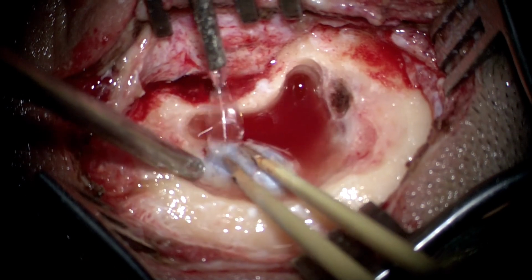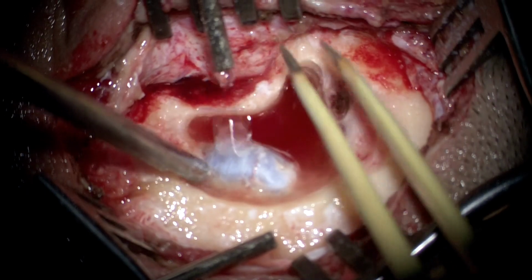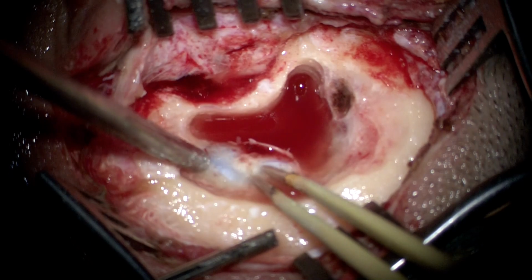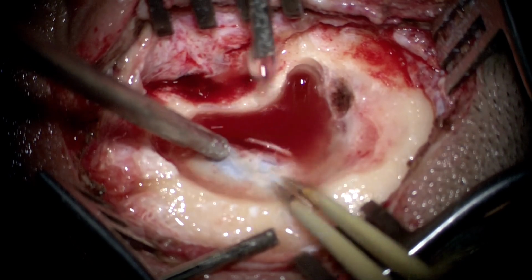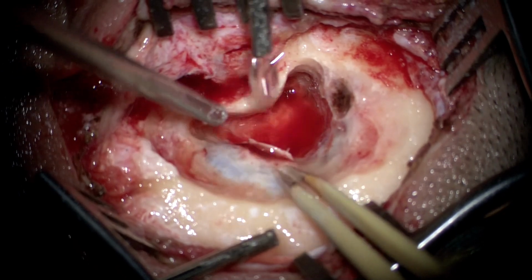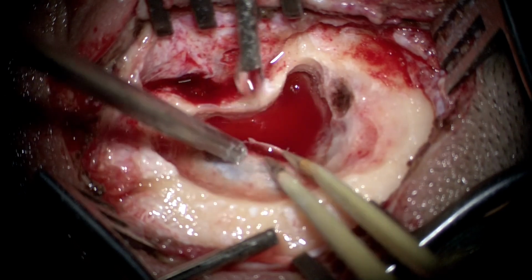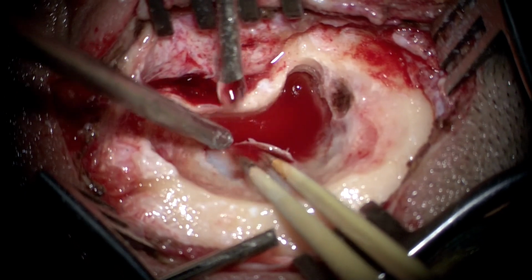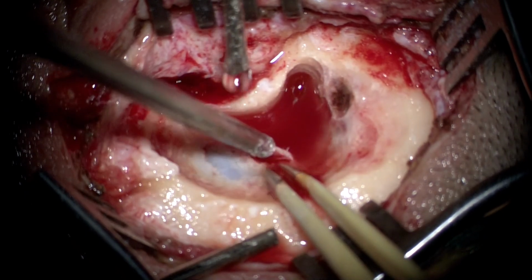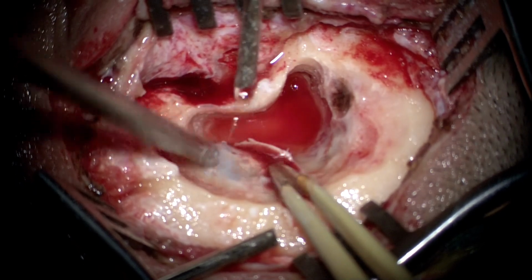Now we use bipolar moving strokes over the sigmoid sinus under constant irrigation, more the better, and this, you see, would start pushing back the sinus. This can also be used over the dura. Here in this situation we are not going to do it with dura because dura is okay for us, and we are just using it over the sigmoid sinus to both cause some hemostasis of the bleeding because of the surface vessels, as well as you can see how the entire sigmoid sinus starts to sit back without any pressure.